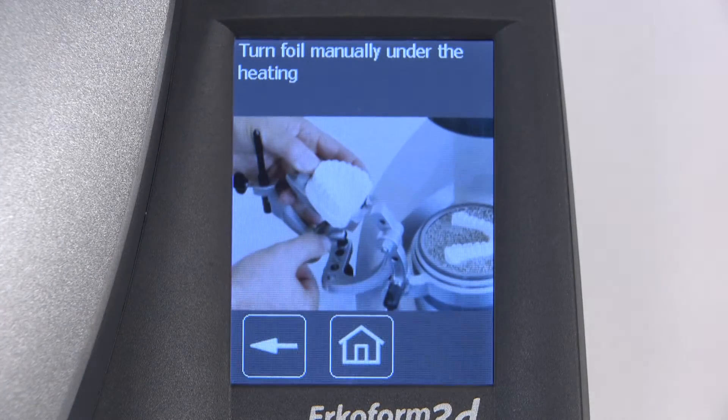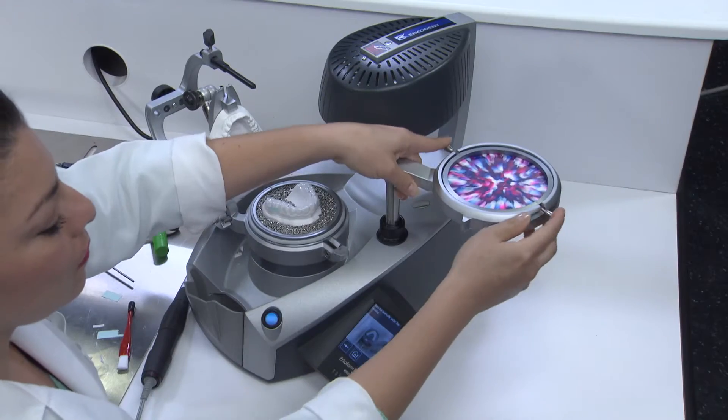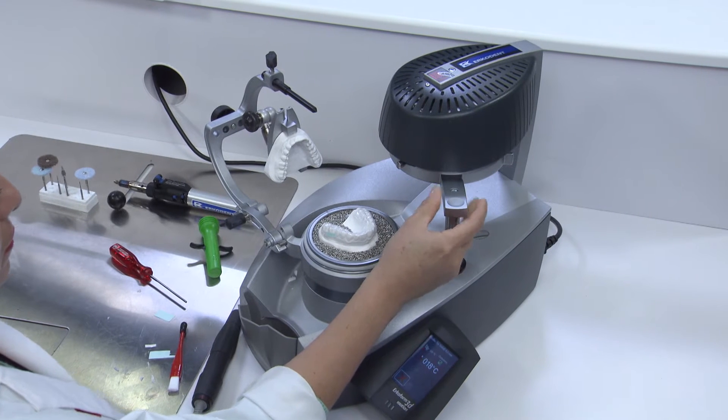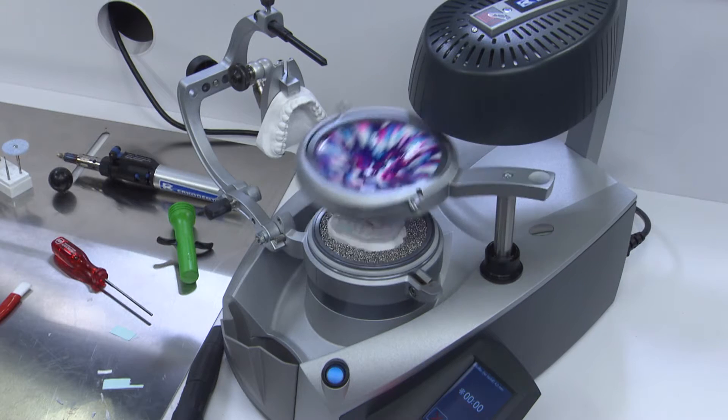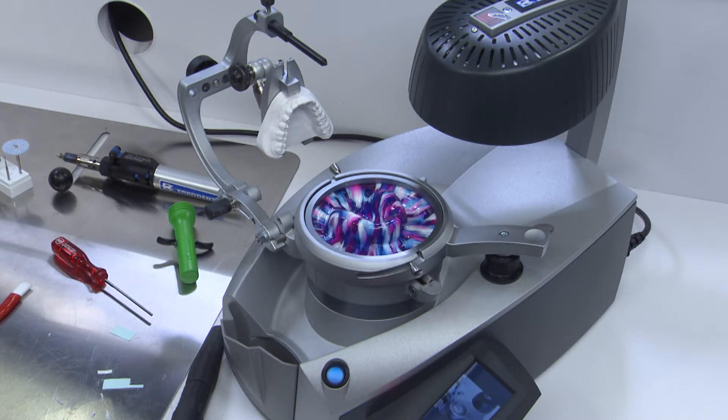The ERCOFORM 3D Motion's Fire and Forget technology features a robotic disc holder that swings out into position above the model, drops into place, and triggers the vacuum function.